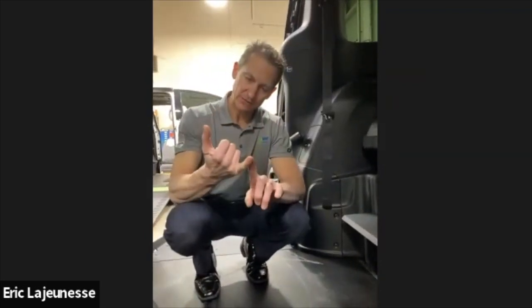Sure. Yeah, so hand controls, like the first car we looked at was the BMW. Any type of vehicle that has automatic transmission, power brakes, and power steering. If it has a clutch, we can't do hand controls. I have clients that will have hand controls off-road. I have a client who works on a farm and he has one of those side by sides, by Polaris. He has hand controls in there and he drives around the farm. So anything that is really automatic transmission, power brakes, power steering, we can do controls in. Okay, great, thank you.